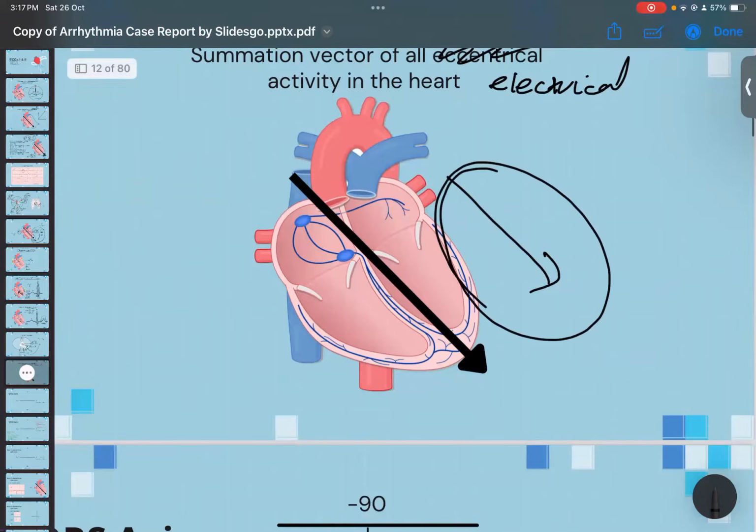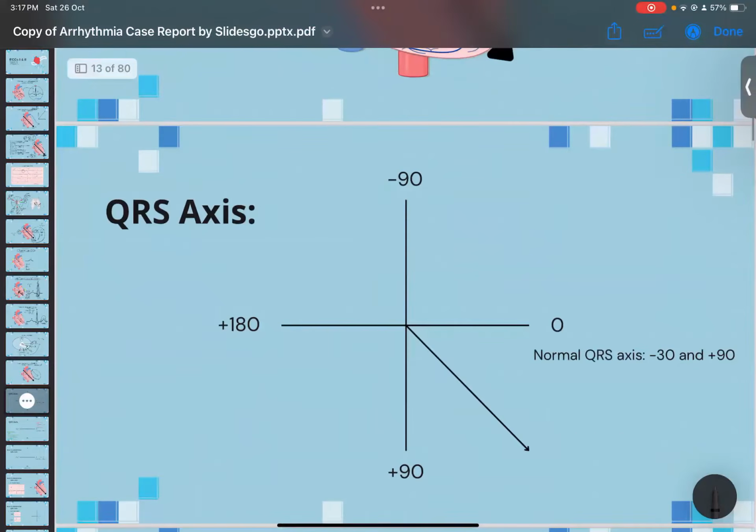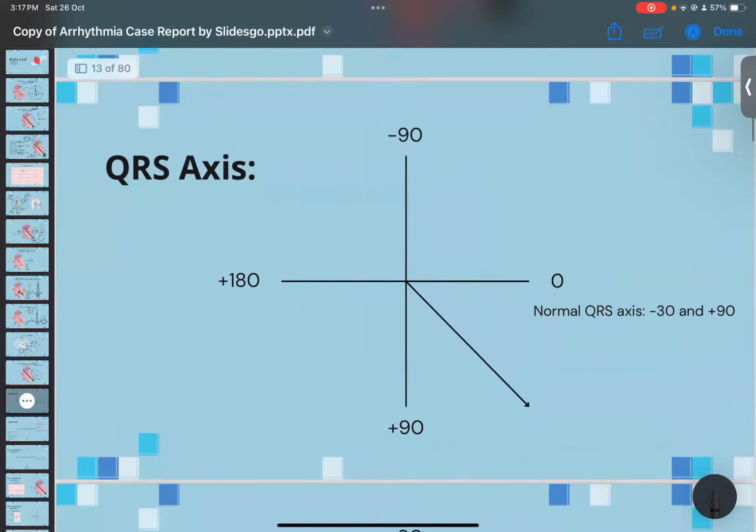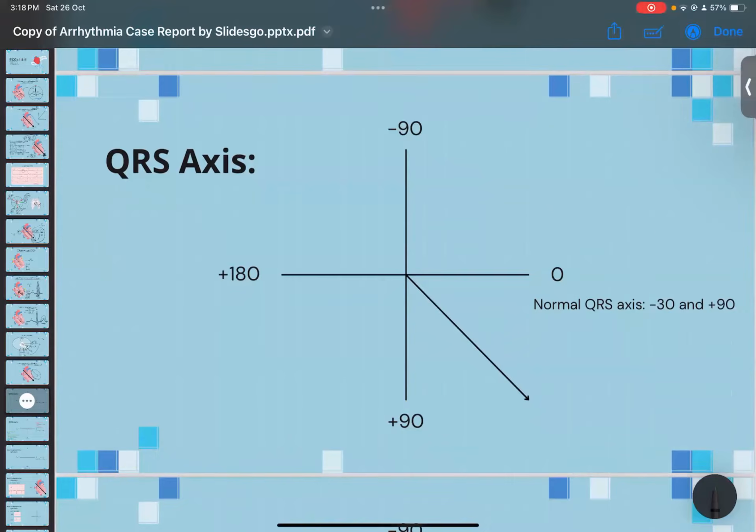Now, why exactly am I specifying this? Because you need it for the QRS axis. I know that Dr. Simon mentioned 3 ways to find out if it's left axis or right axis deviation. Here, I'm only going to discuss one method, and that is the quadrant method, because I find that to be very easy. I'm not sure if he's asked you to go through all the methods, but if there's one method you want to know, and you need it to solve questions and approach clinical scenarios, then I would suggest that you learn the quadrant method, because it's really feasible and really easy.